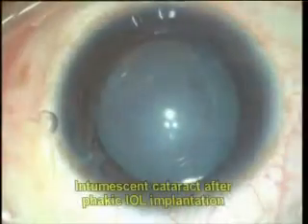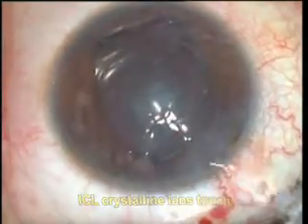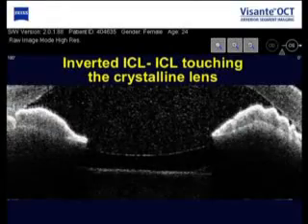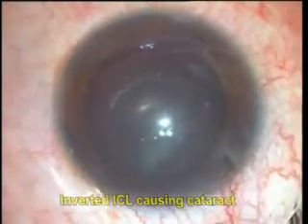Posterior chamber phakic IOLs have become popular for the treatment of myopia. However, just as with any other procedure, complications may occur, and the surgeon needs to be familiar with its prevention, diagnosis and management. An inverted ICL may be diagnosed on ASOCT as well as clinically. An inverted ICL, if left alone, can lead to the development of cataract, necessitating explantation.